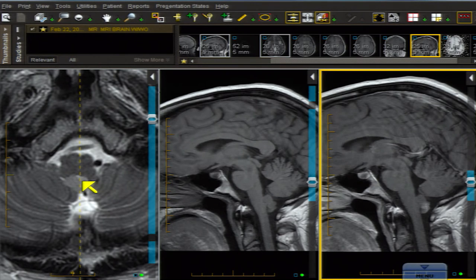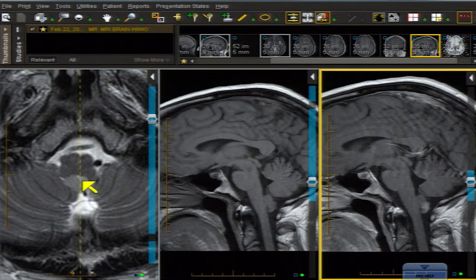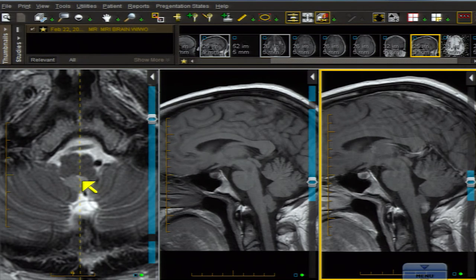The differential diagnosis of intraventricular lesions is extensive, but let's hone in on a specific diagnosis. First, it's bland and gray. Second, the enhancement is scant — sometimes with this lesion there's no enhancement whatsoever. It's a little lobulated and really fills out the fourth ventricle. In fact, ninety percent of these lesions occur in either the fourth ventricle or the lateral ventricle, and this is a subependymoma.